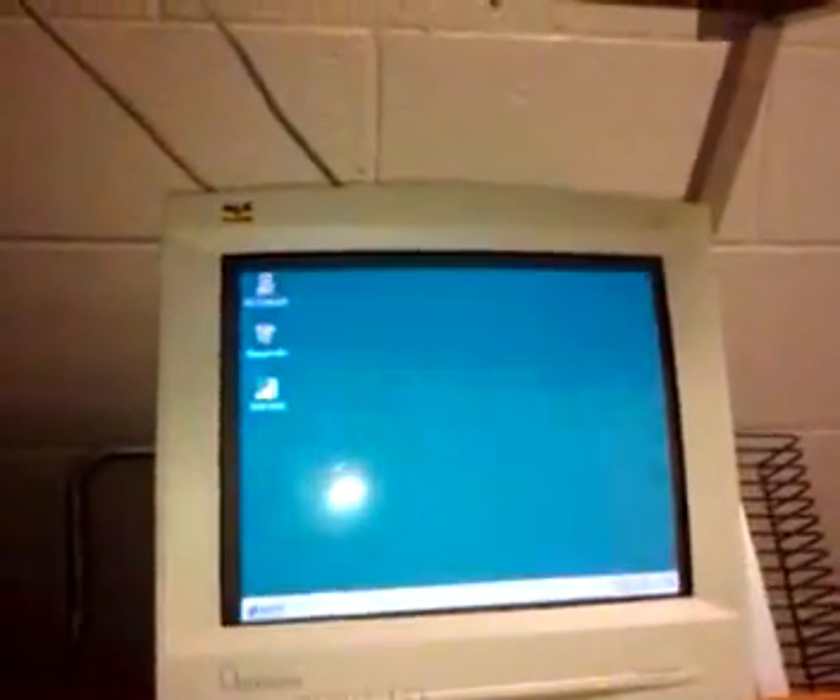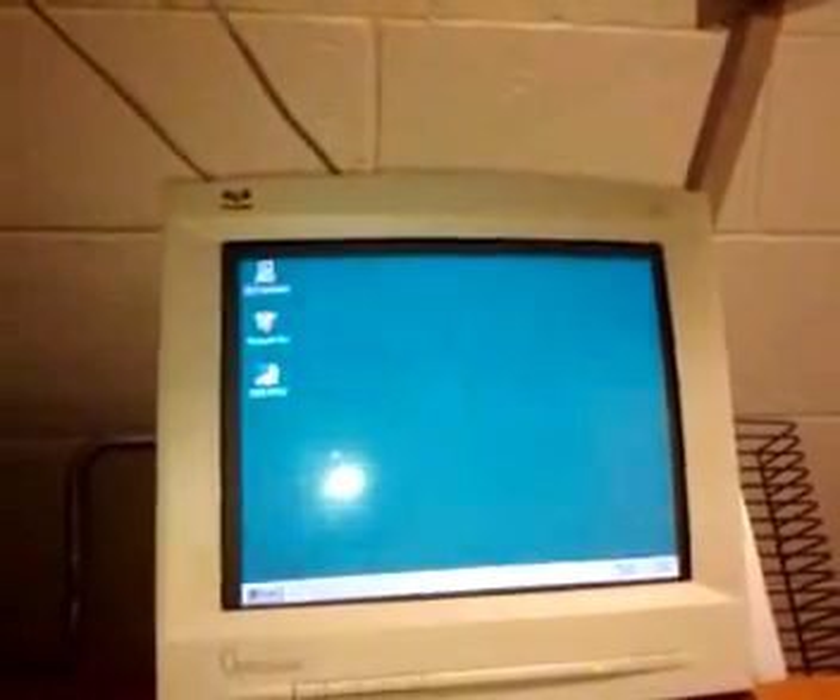To calibrate the BOD Pod, first you want to turn on the computer and select BOD Pod. You'll hear the BOD Pod turn on. You want to let it sit for 30 minutes before doing any further calibration.